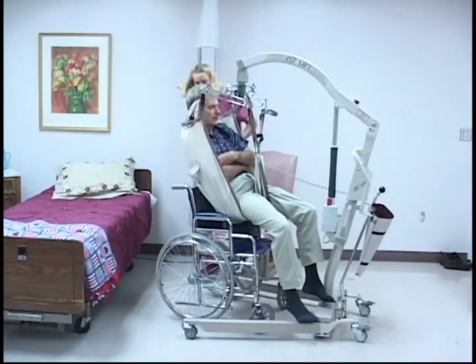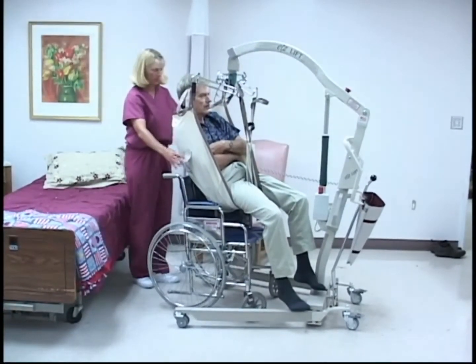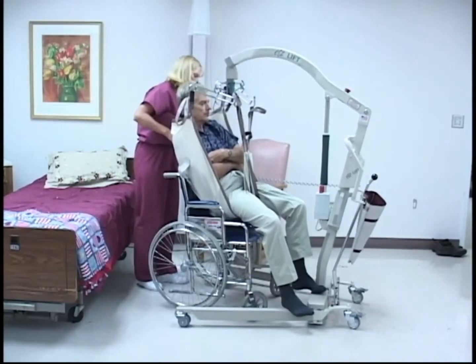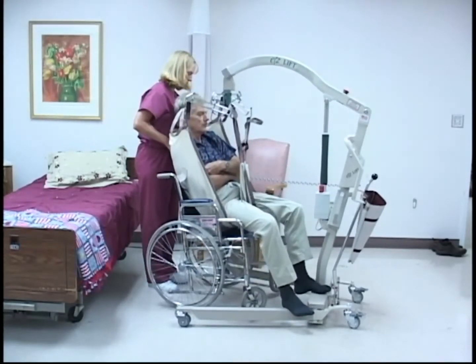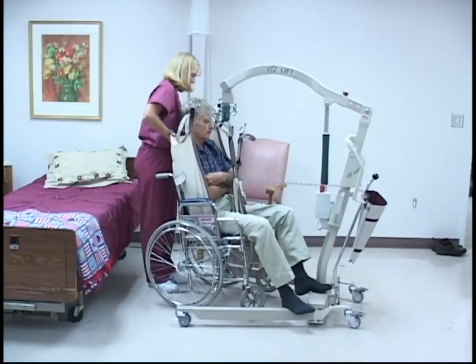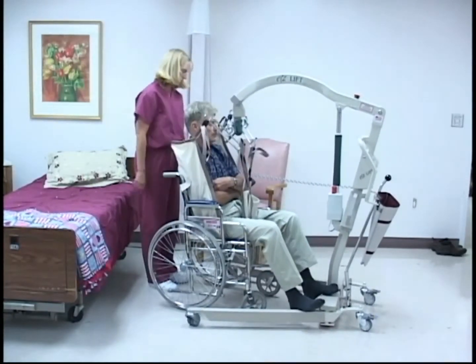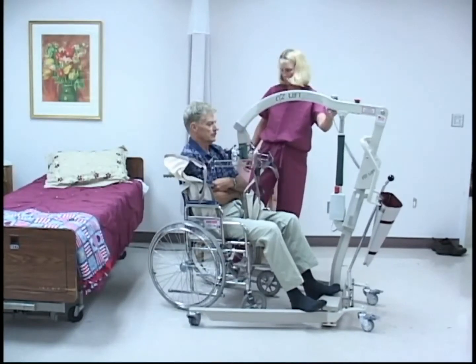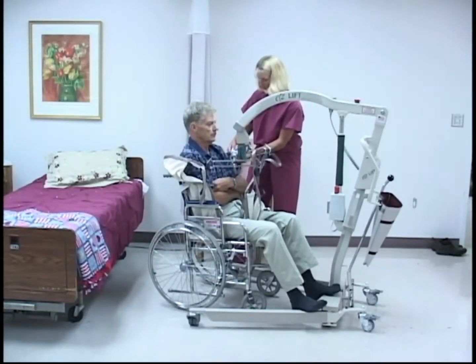Hold your hand level and lock your hand against your stomach as the patient is being lowered. When the patient is 1 inch from the seat, grab the handle and position the patient comfortably in the wheelchair. This will ensure that the patient will be seated in an upright position when fully seated in the wheelchair.